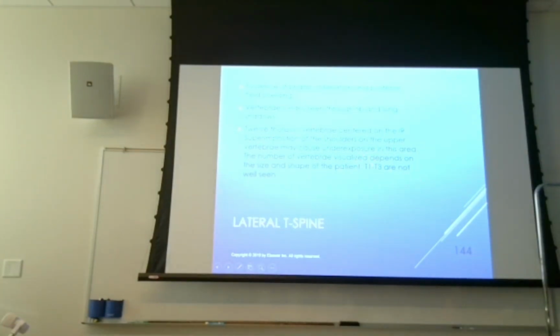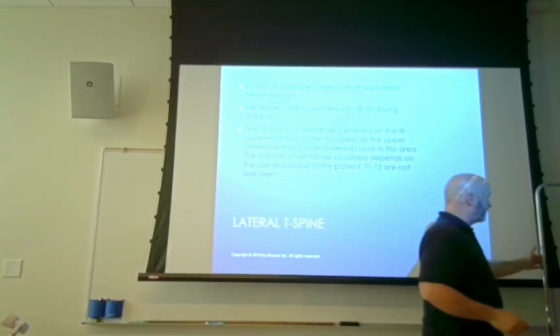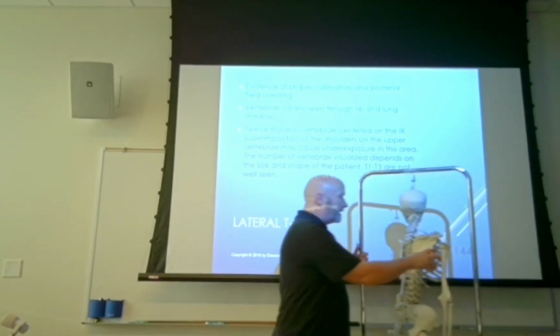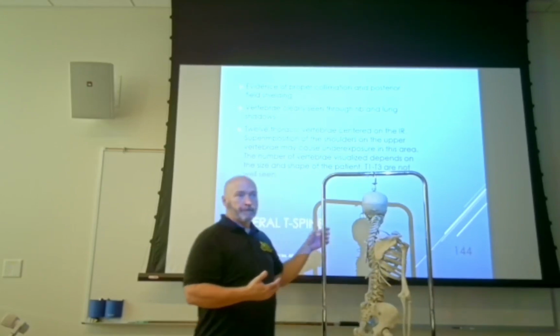Okay. So your central ray is going to be to the mid-axillary region, which is coming right down from the armpit, and you're going to have a tendency to want to think, well, the vertebra is way back here in the thoracic spine, and I would bet that your most common mistake is going to be to position too far posteriorly.